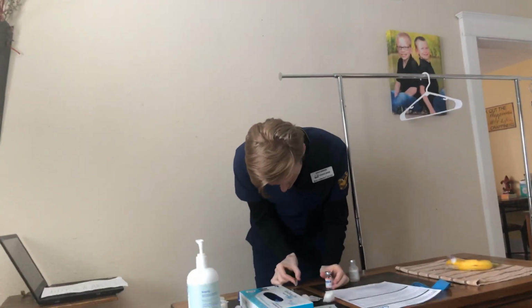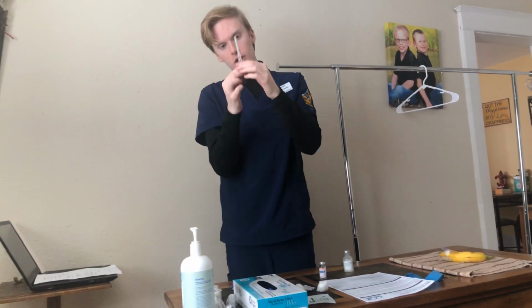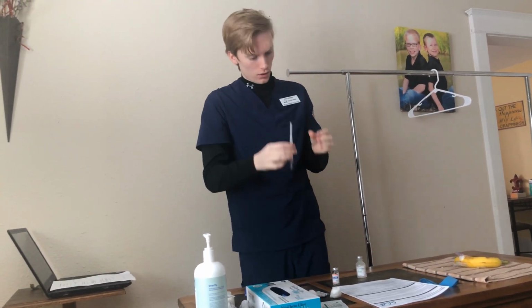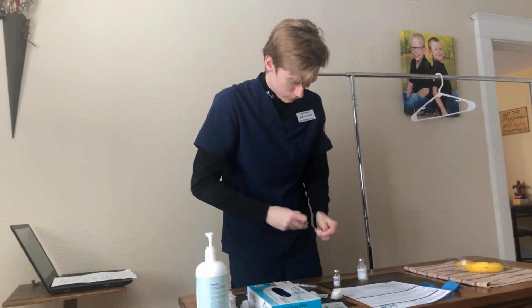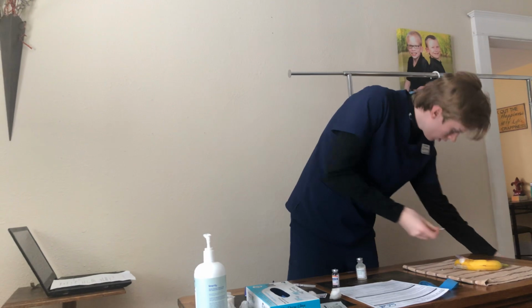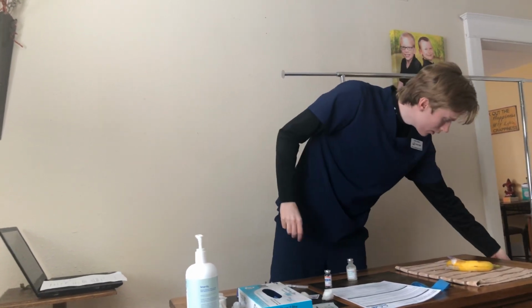Perfect. Do the 1-hand scoop technique. And then I just want to get the bubbles out before I move on to get the saline in. Perfect. Clean off the saline top. Perfect.